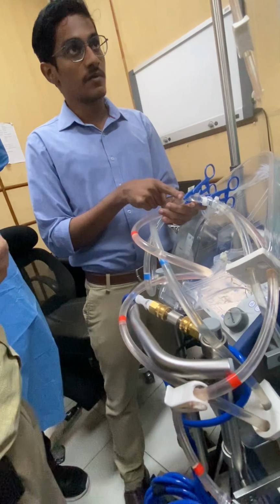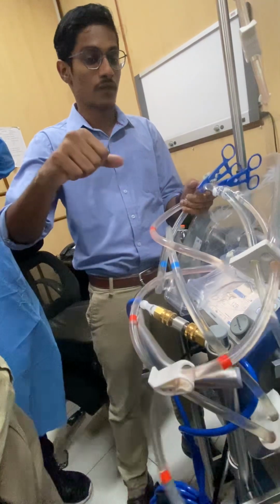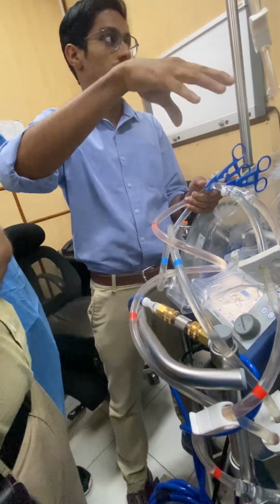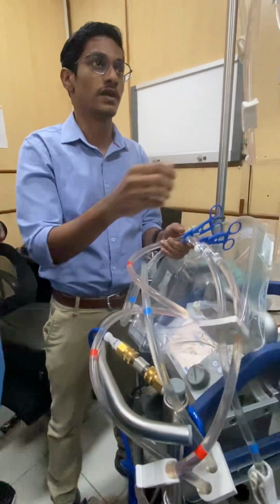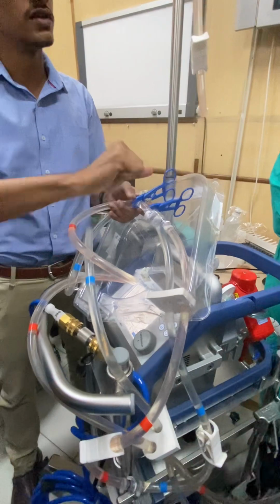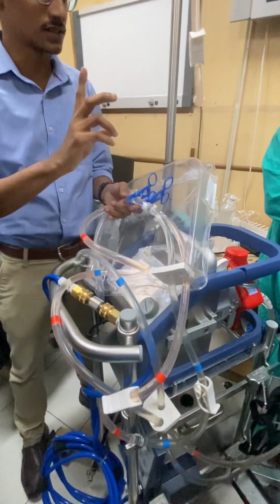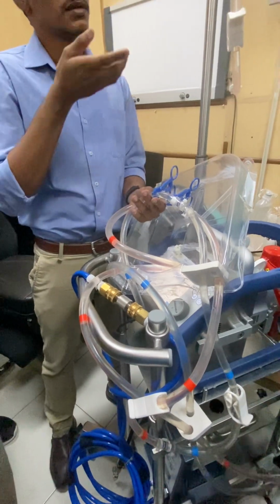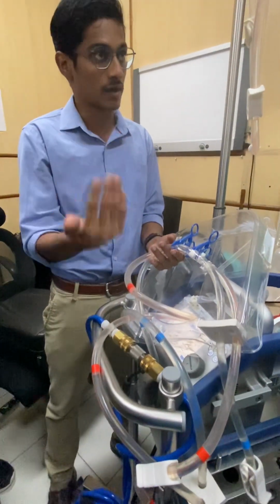Now, as this is clamped here, you will have to cannulate it. One person flushes some saline, so that there is no air while connecting. Once it is connected, these clamps will be taken, and you will give the instruction, go on ECMO.